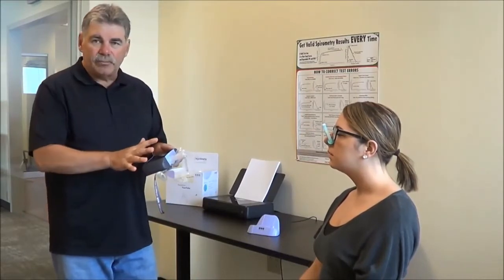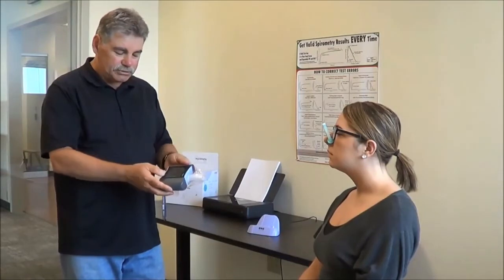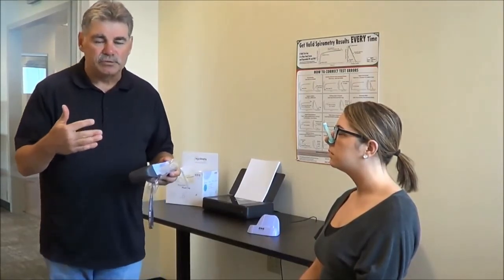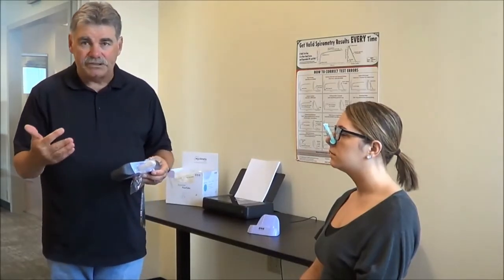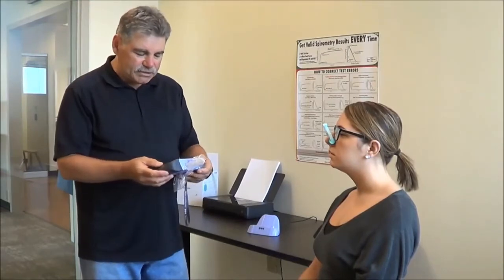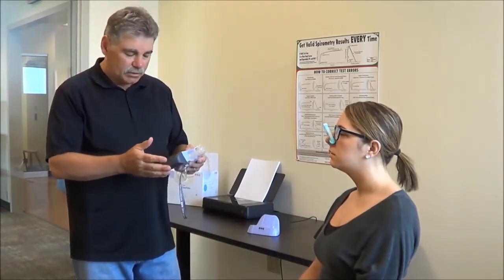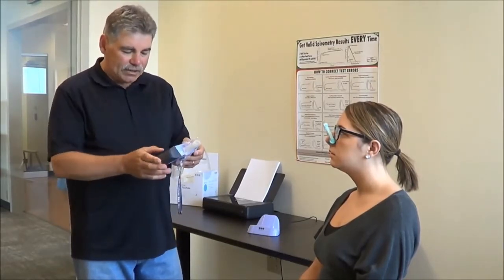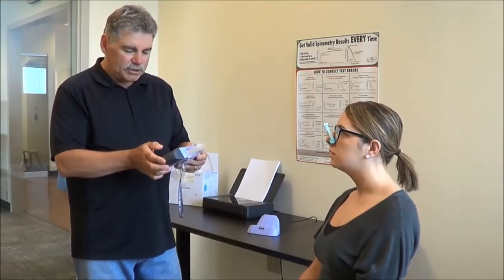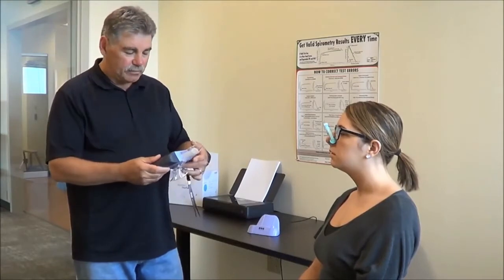Once I'm done entering the patient information or choosing the patient, I'm going to choose start test. I've already chosen to do the most basic spirometry test called FVC, or forced vital capacity. The first step is asking me to block the flow tube on the first blow. I've got my bag on there, so I'm going to say okay. A couple of seconds after the baseline is set, it's telling me that it's ready for the blast.